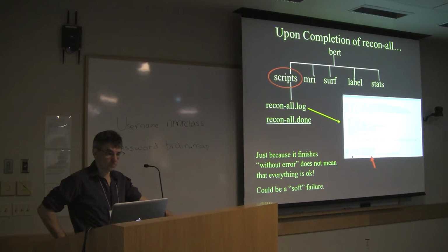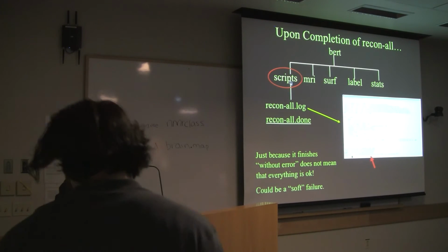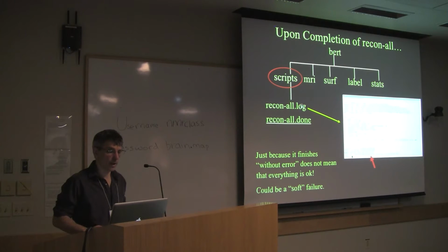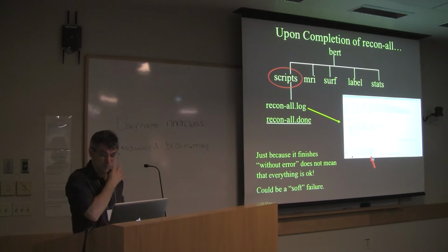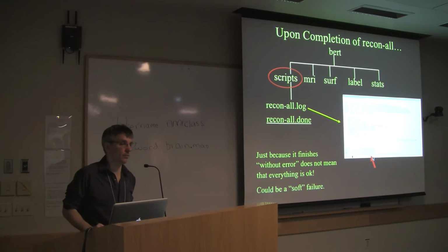So hard failure. If you remember from the previous talk that I gave, when you finish recon-all, you have a folder which is your subject's name, and it has these folders in it: scripts, mri, surf, label, stats, and under scripts it has this recon-all.log file. And when you run it, it's going to print out something nice at the end that says, FreeSurfer finished without error, and then all you know at that point is that there's not been a hard failure.